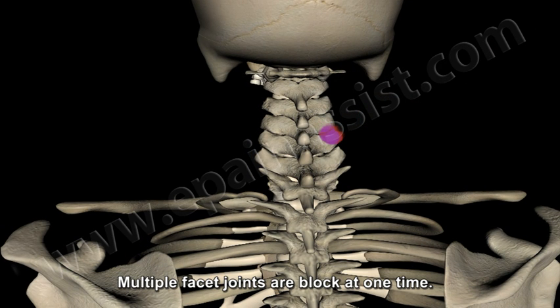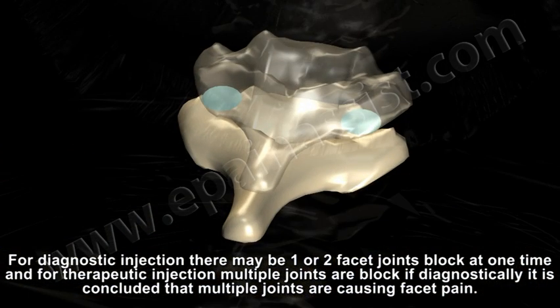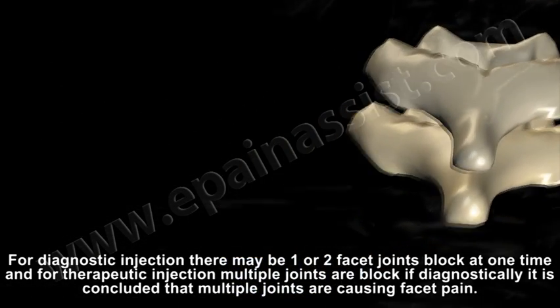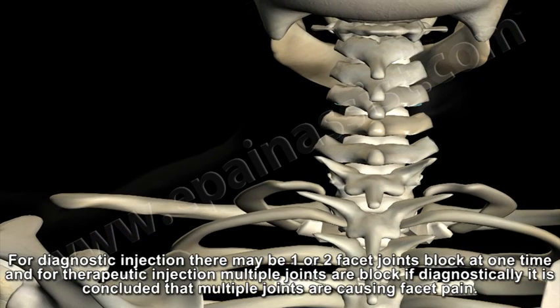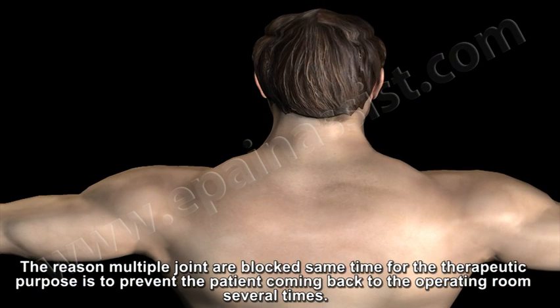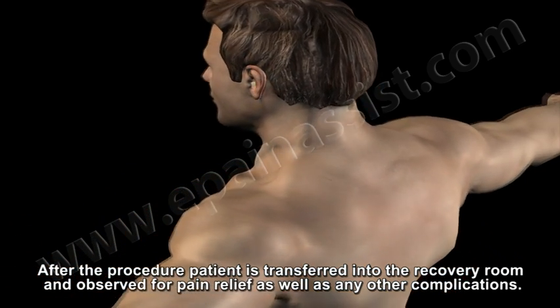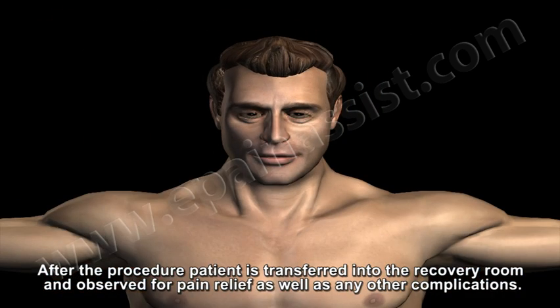Multiple facet joints are blocked at one time. For diagnostic injection, there may be 1 or 2 facet joints blocked at one time, but for therapeutic injection, multiple joints are blocked if diagnostically it is concluded that multiple joints are causing facet pain. The reason multiple joints are blocked at the same time for therapeutic purpose is to prevent the patient from coming back to the operating room several times. After the procedure, the patient is transferred into the recovery room and observed for pain relief as well as any other complications.